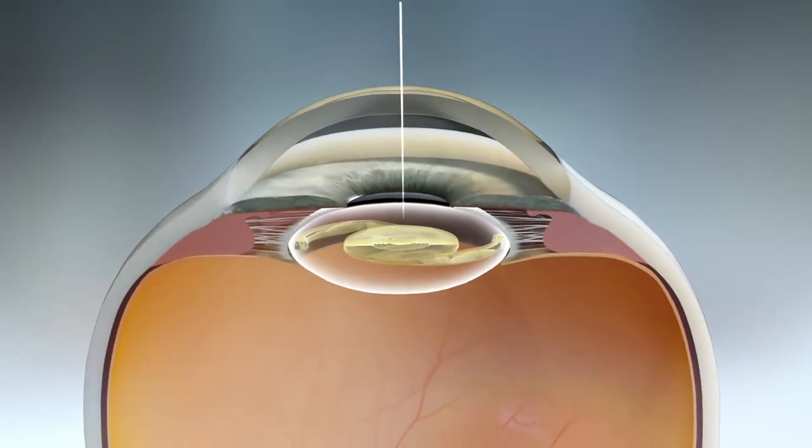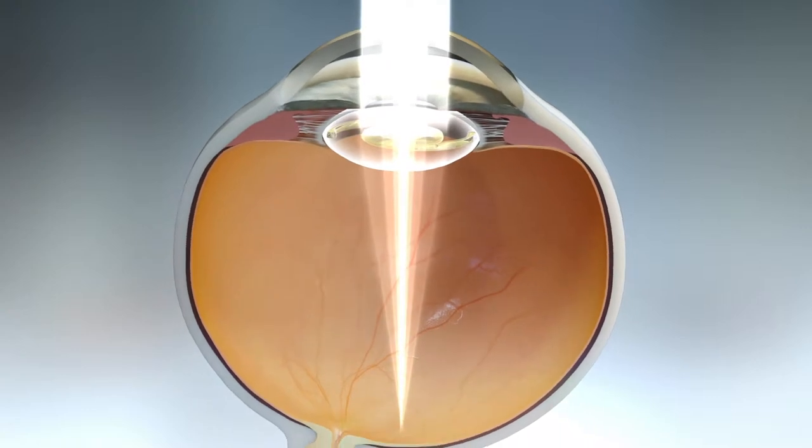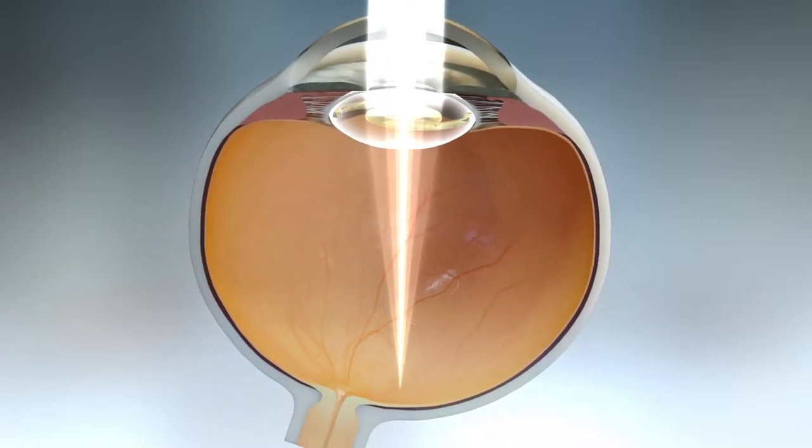This, combined with negative spherical aberration, results in contrast sensitivity comparable to the number one selling Acrosoft IQ monofocal IOL.